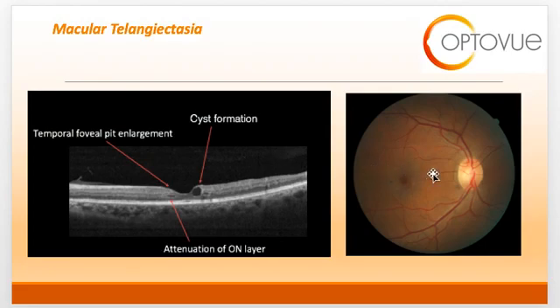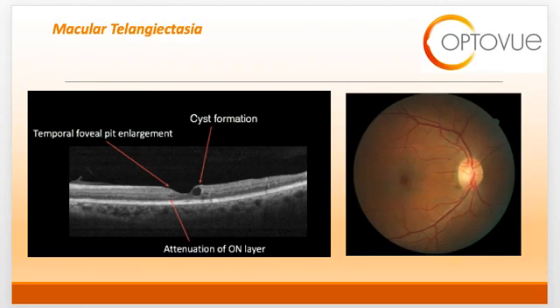Fundoscopically, you can see here that there is a right angle venule. There is this little yellow spot, which we like to say is a superficial crystalline deposit. There's some hyperpigmentation here, which is what we call an RPE pigment plaque. Other things you may notice is really an overall graying or reduced retinal transparency of the parafoveal retina, and eventually there may be development of neovascular complexes.